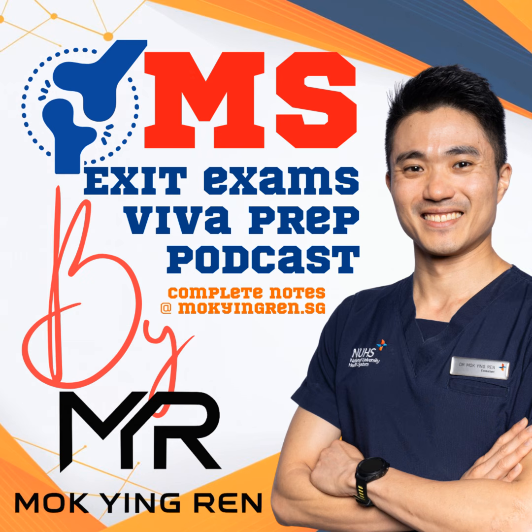Let's switch to patellar resurfacing. Yes or no? What's the traditional resident stance? The classic position has generally been selective resurfacing, meaning you only resurface the patella in specific cases like severe arthritis on the back of the kneecap or perhaps in patients with rheumatoid arthritis where the bone quality might be poorer. And what did the trials say about that? Again, we see some conflict. The KAT trial, and also a big meta-analysis back in 2012 by Pilling et al. in JBJS, they both found essentially no difference in functional scores or in rates of anterior knee pain whether you resurfaced the patella or left it alone.